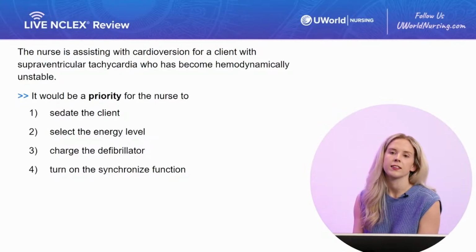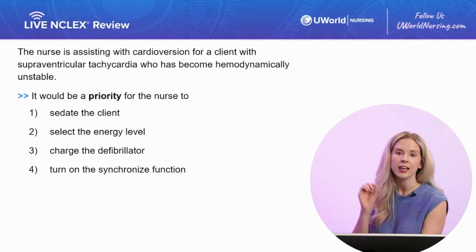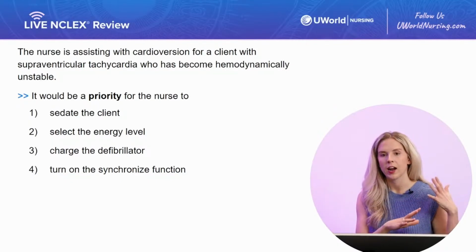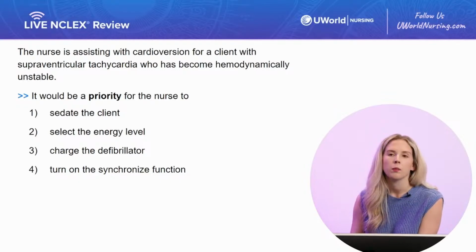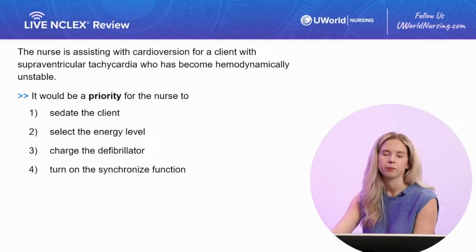So the sync button is going to allow the machine to pick up on the heart's existing electrical activity and deliver the shock at the right time. We don't want the machine to fire at the wrong time and send that client into VFib. So again, we want to turn on that sync button. We are making sure we are cardioverting. We're not defibrillating in this case.